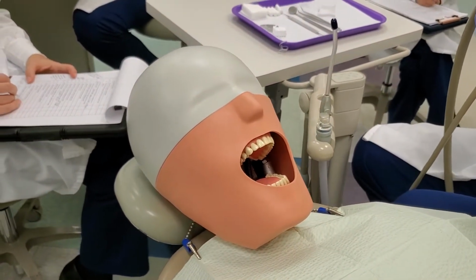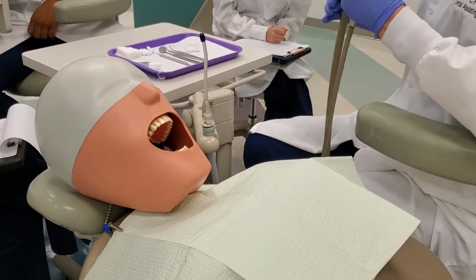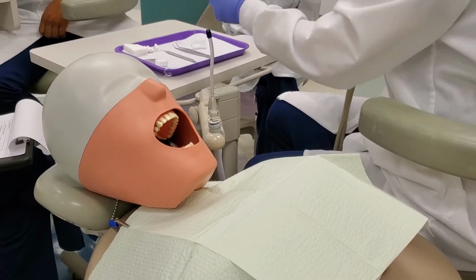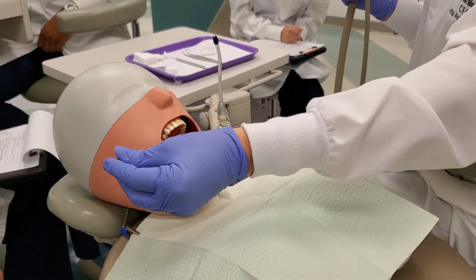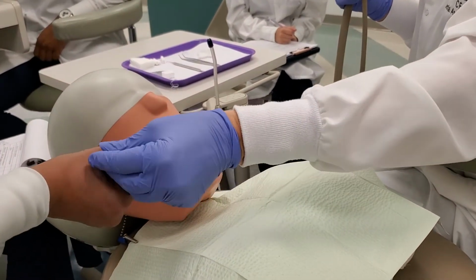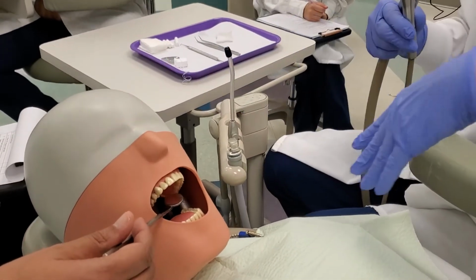Okay, so now we're going to clear the mouth mirror. So you will be sitting here. I'm going to come around. So Larry, you're going to be me, okay? So all you have to do is just hold the mouth mirror here. So we are working on lingual. Should I wear gloves? No, he's fine.